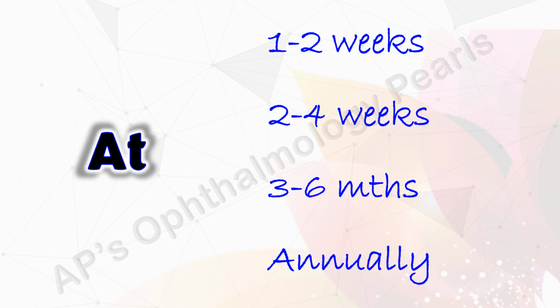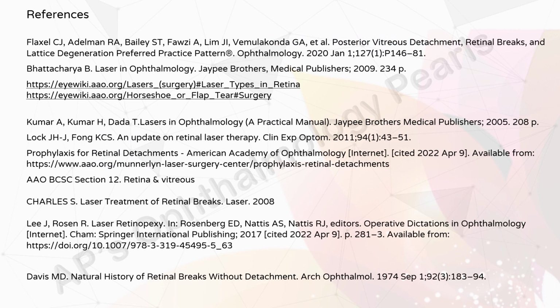A proportion of patients develop new breaks during long-term follow-up or after cataract surgery. So even if treated, patients should undergo long-term follow-up. So that's it for today.